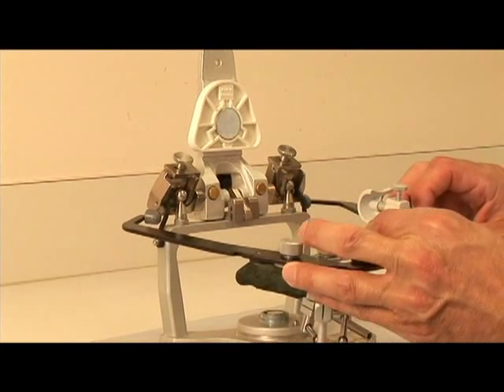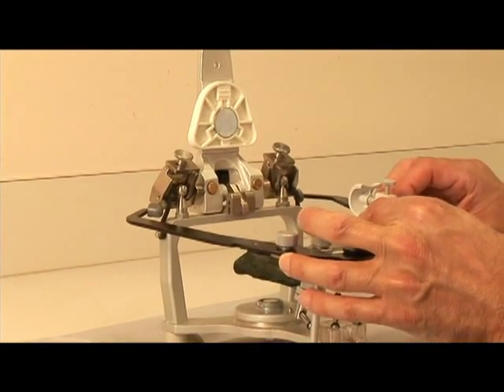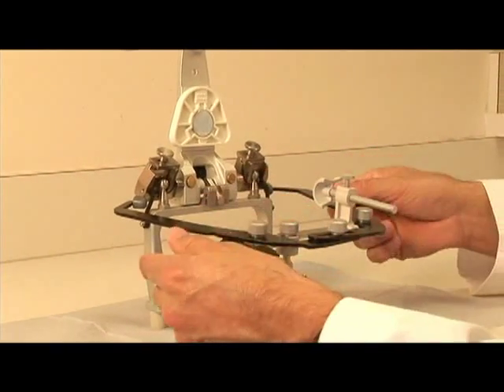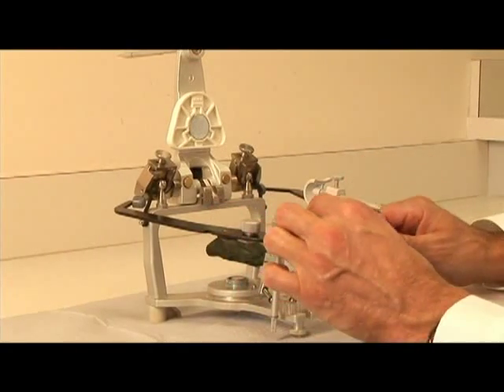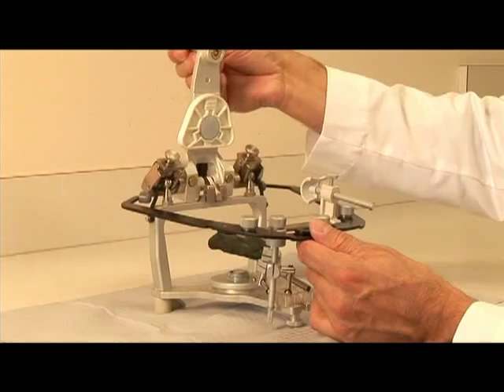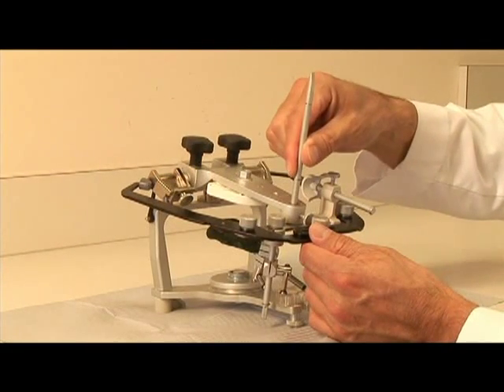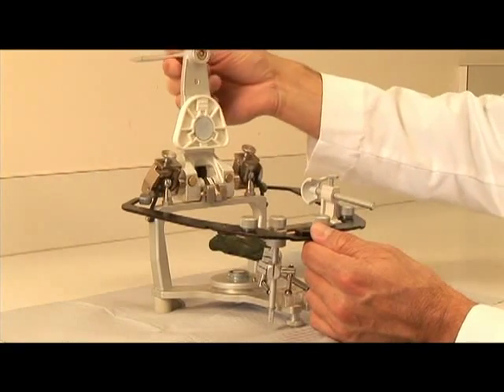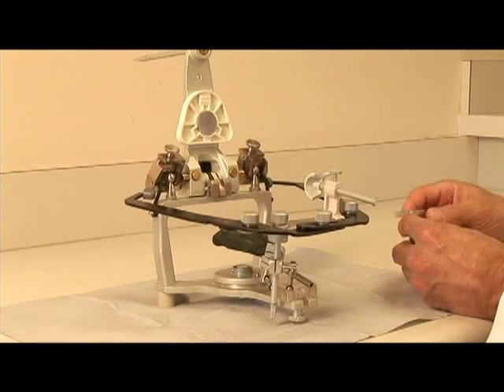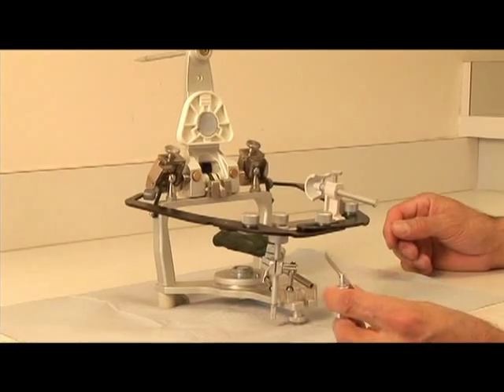the condylar element. Tighten the anterior face bow thumb screw and check to make sure that the side thumb screws are secure as well. Check to make sure that the upper member of the articulator will close down on the crossbar without any interferences. If you haven't done so already, slide the Nasion relator assembly out of the way.